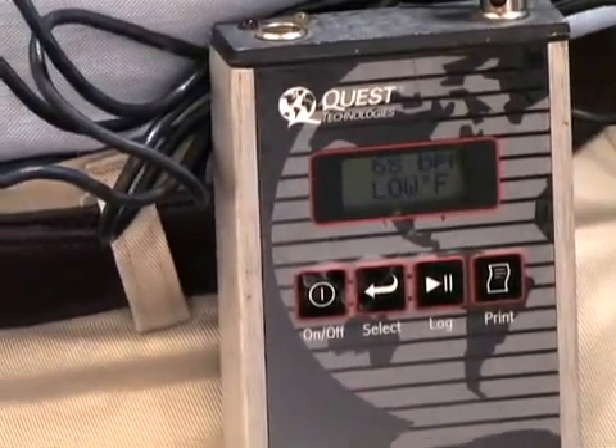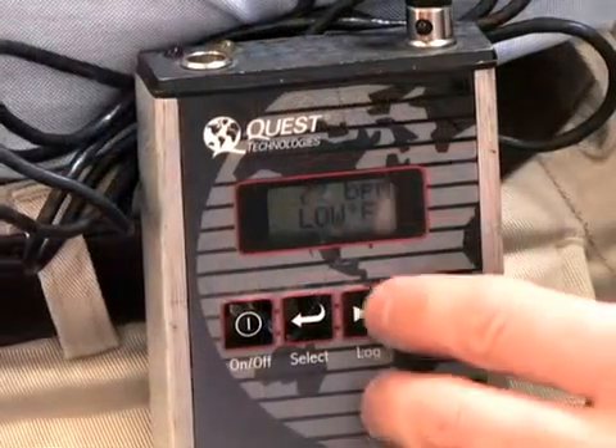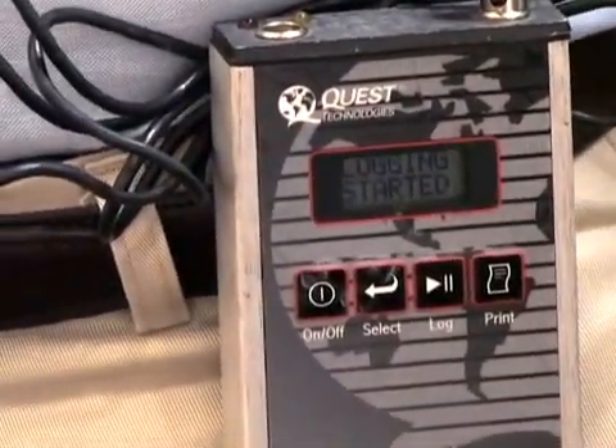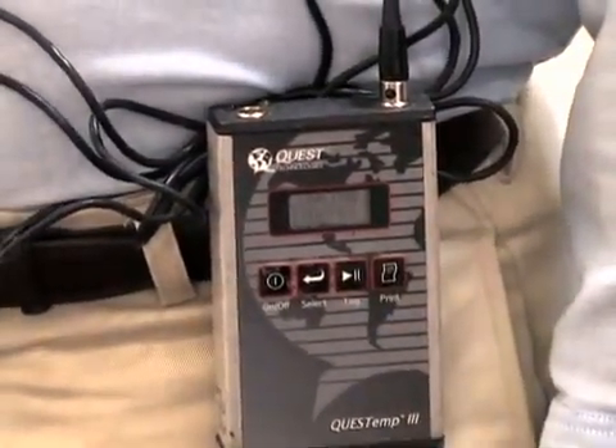The sensor records the heartbeat rate and core body temperature as it is displayed on the unit screen. To begin logging of the data, press the log button. When sampling is done, press the log button twice. The screen will display 'logging stopped.'